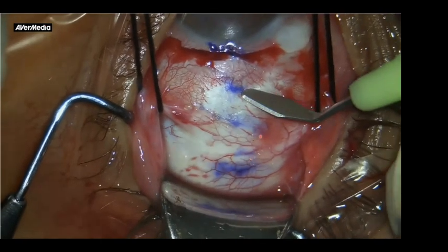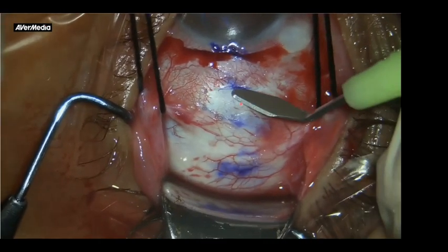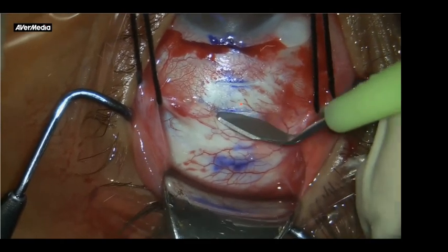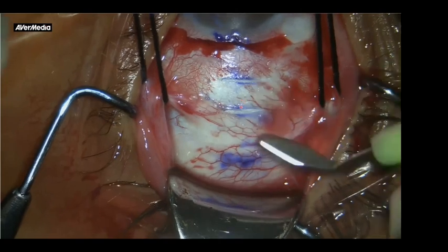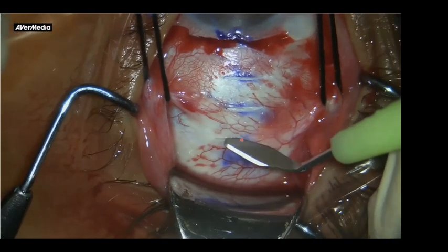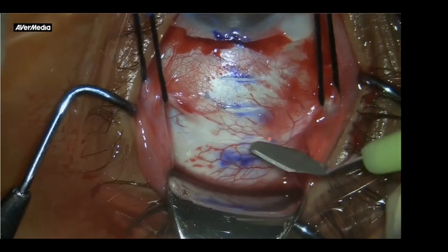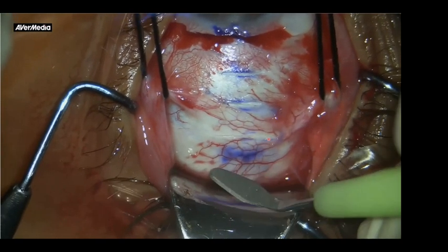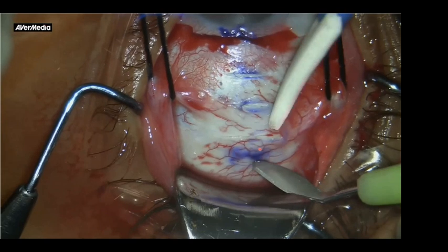And again, I try to use the crescent gently, because if the crescent is very sharp, it can go inside the eye. So I dissect those incisions. And then sometimes we can find remnants of episcleral tissues. You can take those away with the knife.